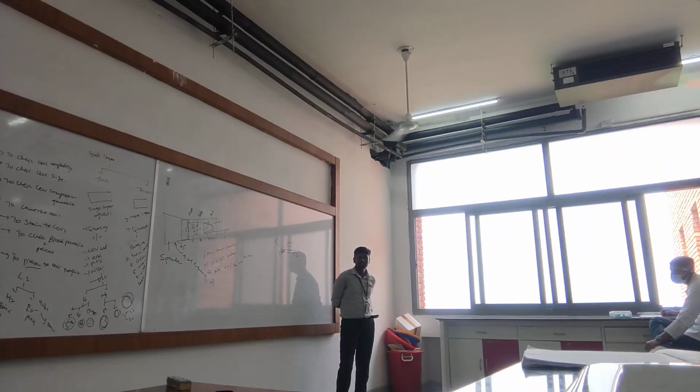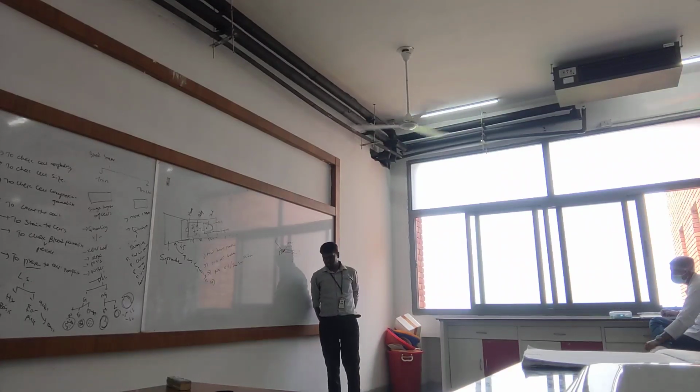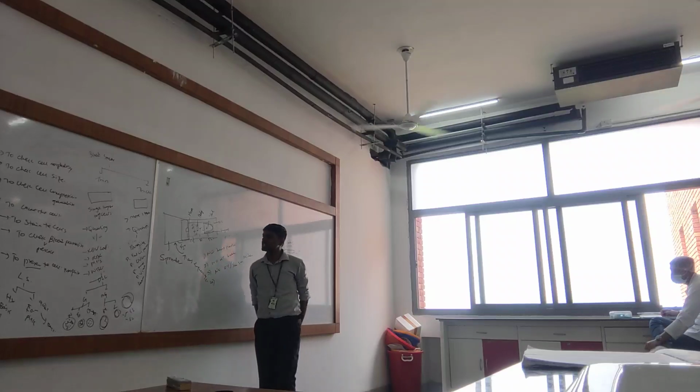Any doubts? On the board there won't be doubts, but once you are doing it, you will get challenges. Today we will practice this smear preparation and check red blood cells. You can clearly check red blood cells without any stain, because the cells are already red in color. Beautifully you will see many red blood cells. They are really beautiful. So today we will perform thin smear preparation.